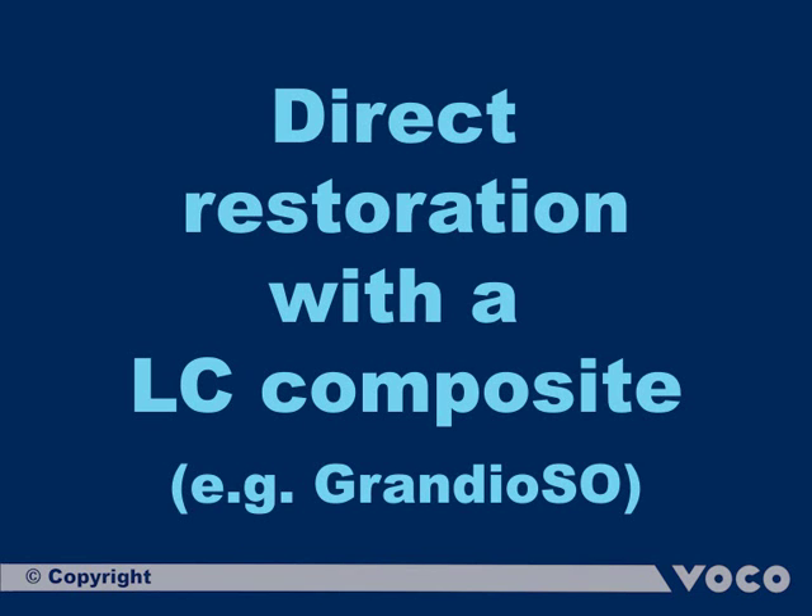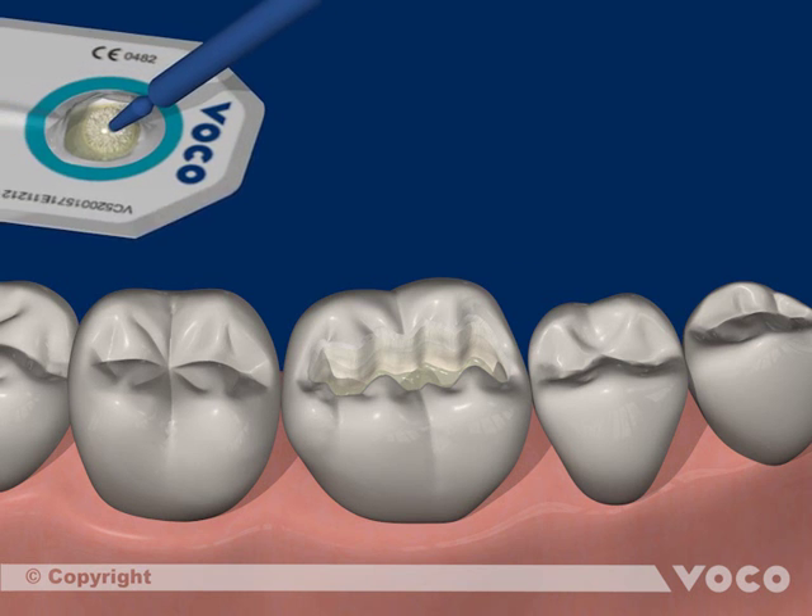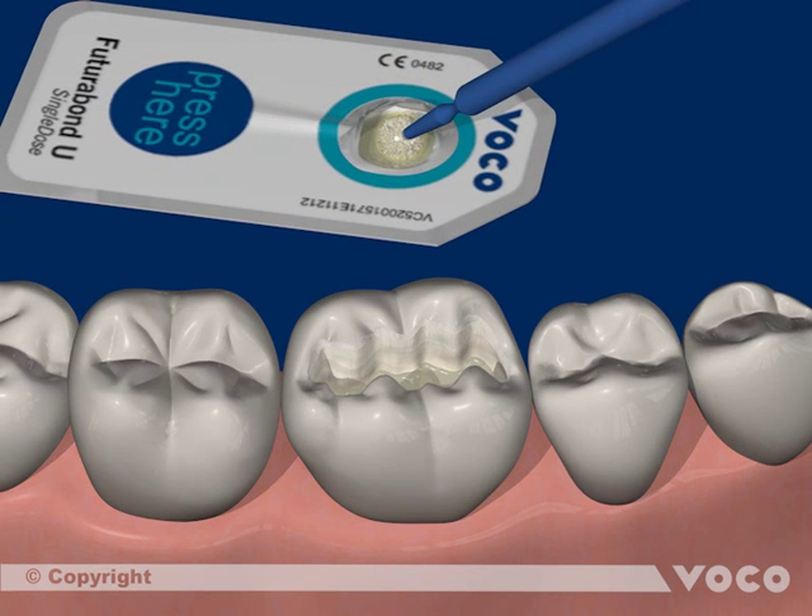Direct restoration with a light curing composite. The following sequence shows a direct restoration of a class 1 cavity with a combination of Futura Bond U and light curing composite.